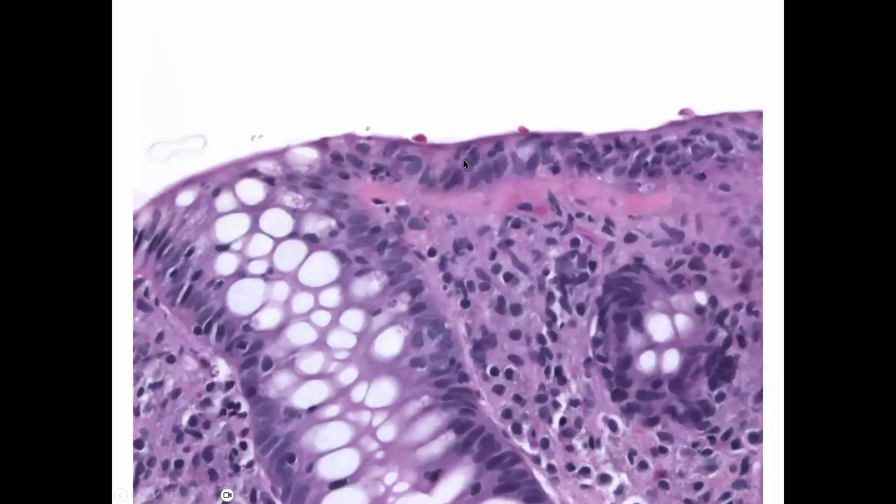When we look at that on higher power, it looks a lot like what we saw in celiac disease. You can see all of these little dark round nuclei, and there are so many of them that they're overlapping on top of the surface epithelium so that you can hardly see it. You see diminished goblet cells, so there's some damage to the epithelium that it's not able to mature normally and produce things like goblet cells. So this is a disordered, jumbled up and attenuated surface epithelium associated with increased lymphocytic inflammation.